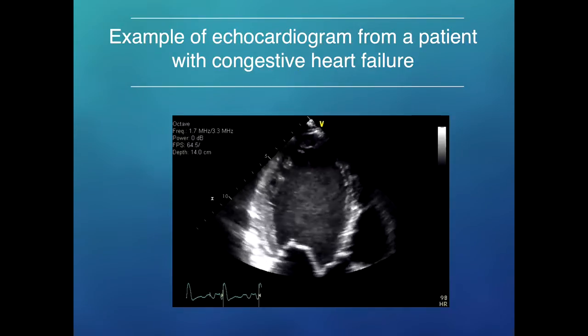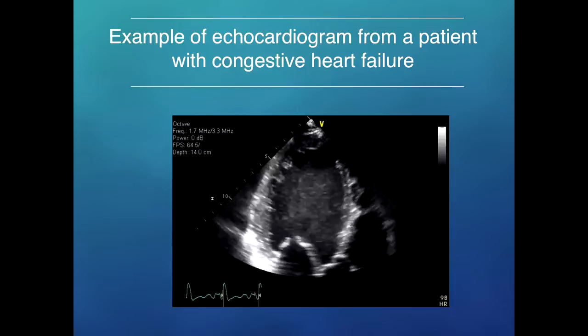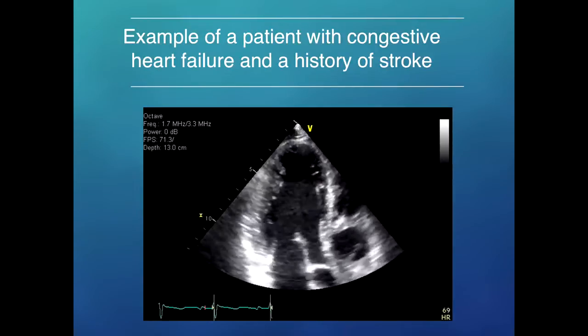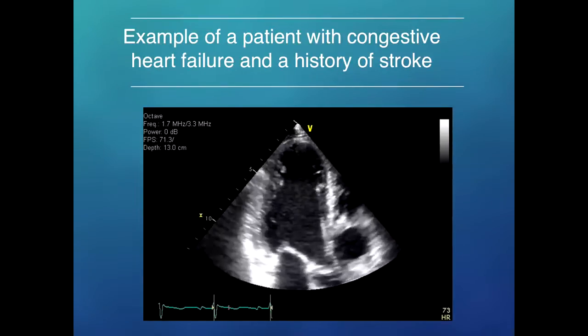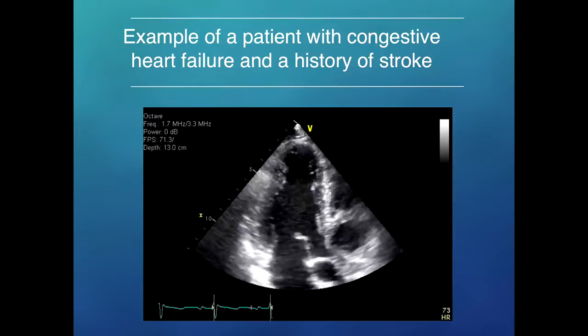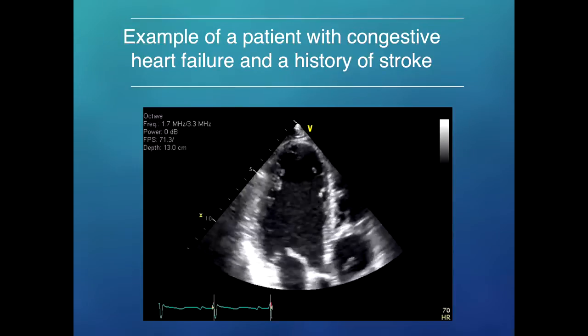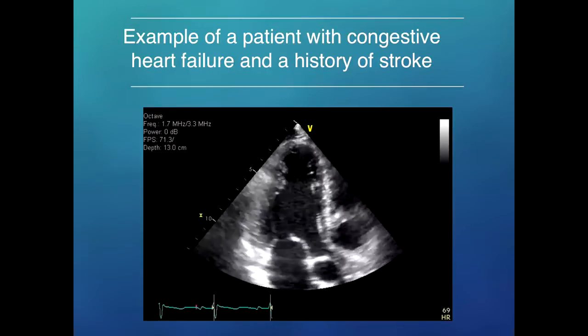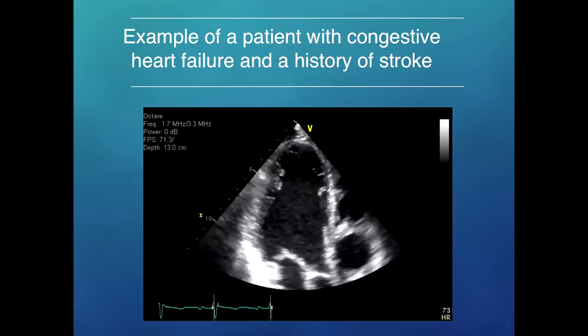Again, you can imagine that the blood flow is going to be much different, and there's going to be much more stasis in this person's heart, an increased risk of a blood clot forming. And finally, here's one last example I'll show you. This is a woman who also has congestive heart failure, with an abnormal heart. This was due to a genetic abnormality that she was born with. Her heart is a little bit better than the last one.